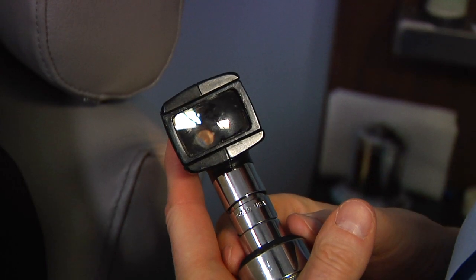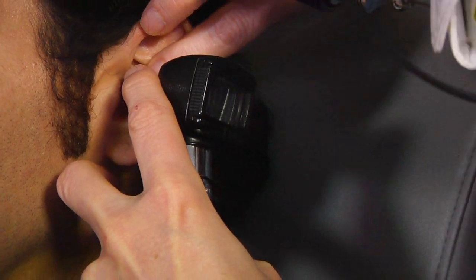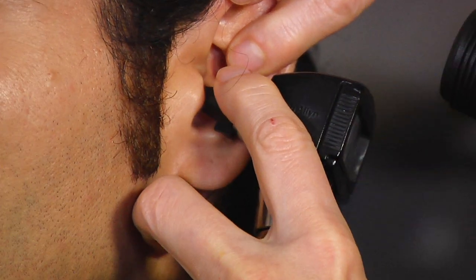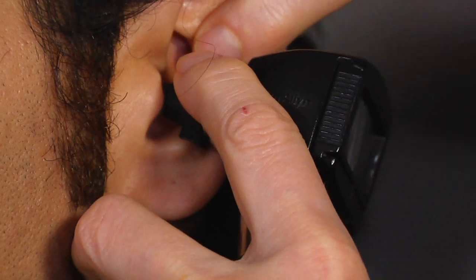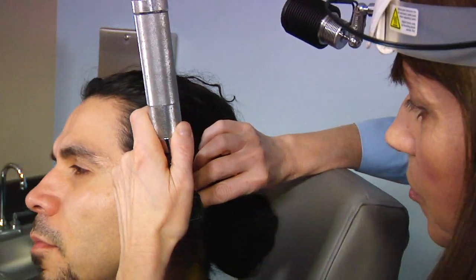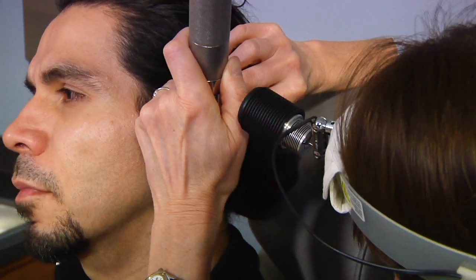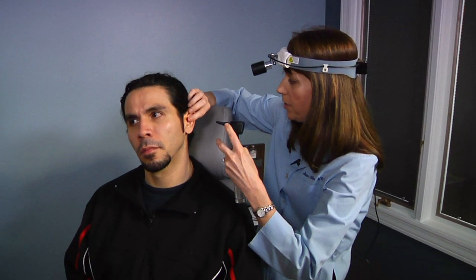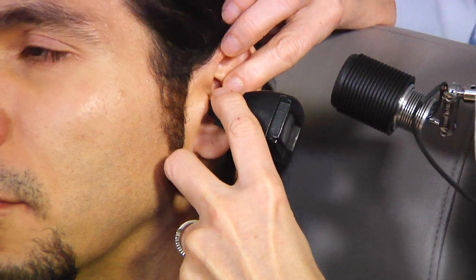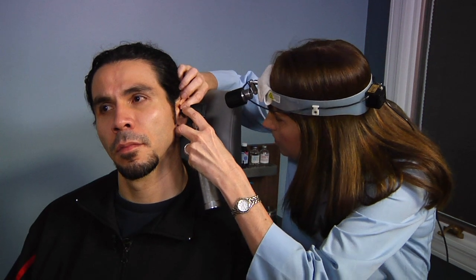When using the otoscope to examine the ear, pull gently posteriorly on the helix — a maneuver that straightens the normally S-shaped canal and allows for better visibility. One should use the largest speculum that the ear canal can accept, as this increases visibility. Another way to hold the otoscope, which is especially helpful in children, is in a rather upside-down position, which gives added stability. It is important to remember that when inserting the speculum, stay on the cartilaginous canal, as the bony canal is quite sensitive. Remove any wax out of the way to better visualize the tympanic membrane.